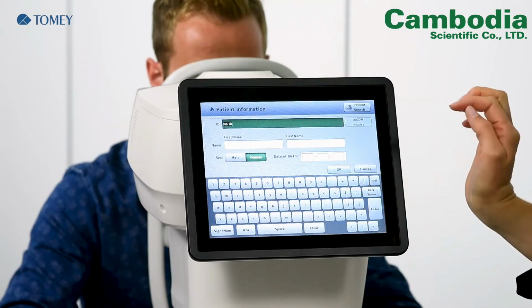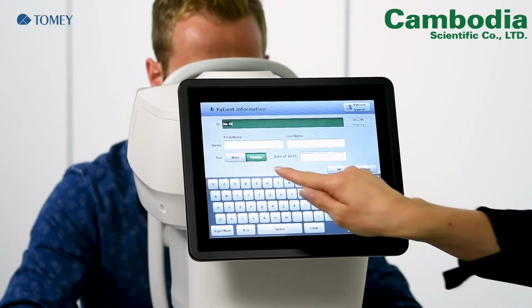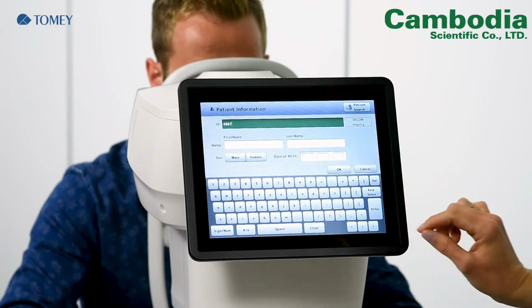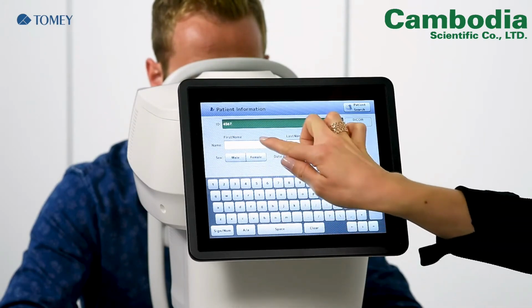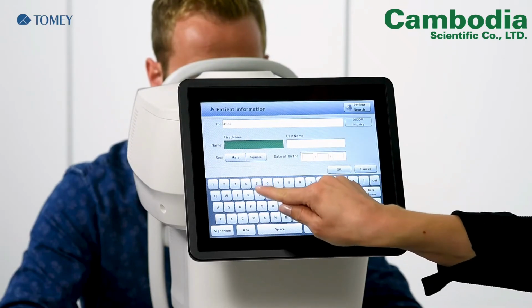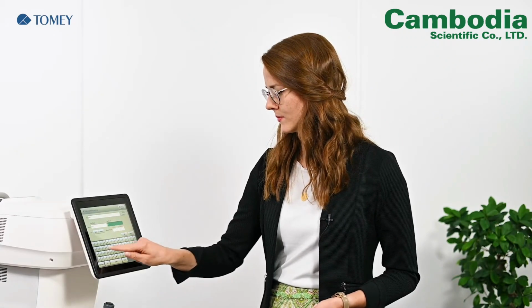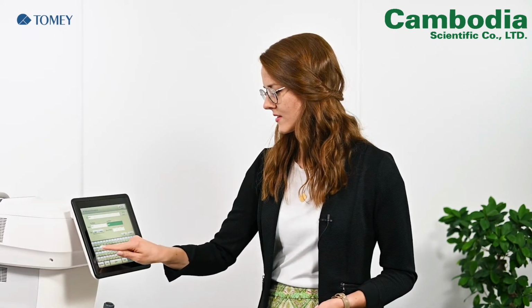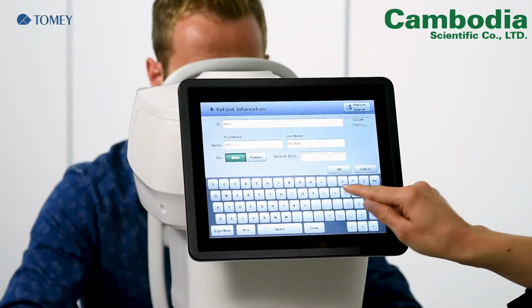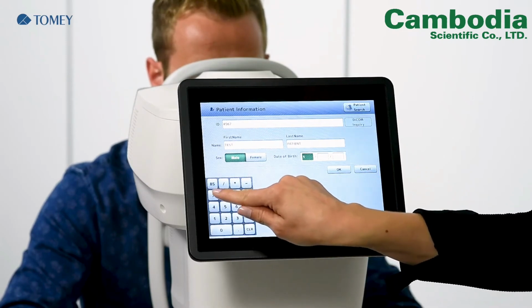It is up to you if you want to enter an ID or not. In this case, we will start with a number ID, just an example. And name, we will have a test patient. He is a male patient and some random date of birth.